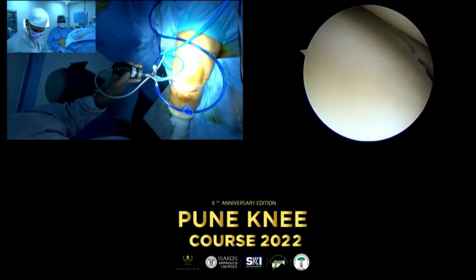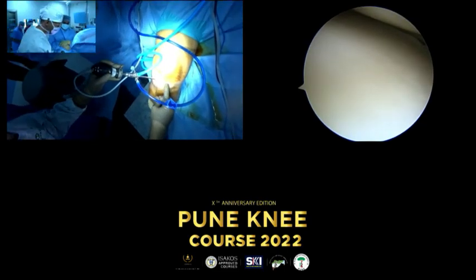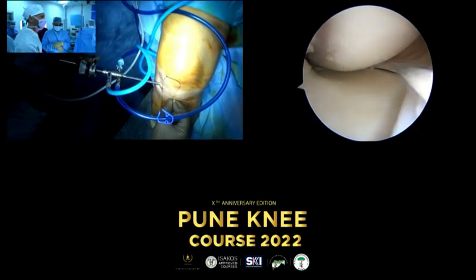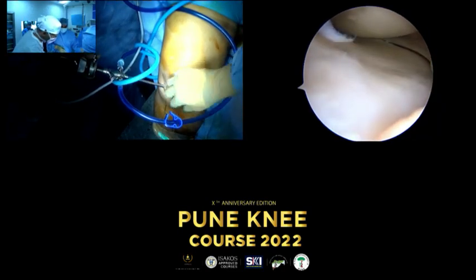I will perform two medial portals, one for the introduction, a big one, right parapatellar. Right here. Okay, can you take it out? Thank you.